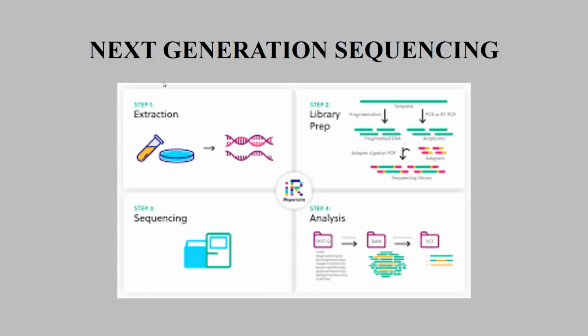Nowadays, there are automatic devices and programs used for next generation sequencing. In this case in the lab, it's possible to make copies of several genes and find a mutation in a huge amount of genetic information.